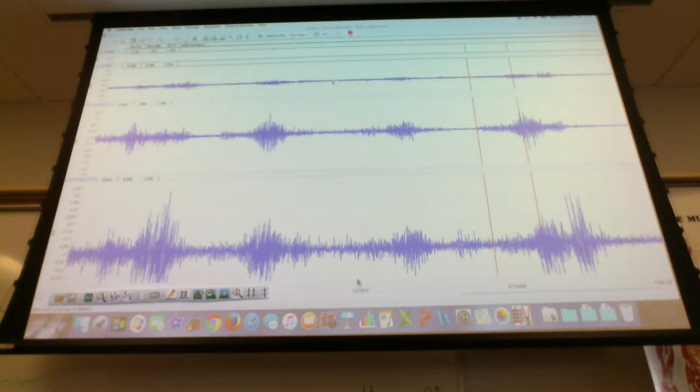You wanted to put in that box. The number of what? Millivolts, right? Millivolts of what? Of how much force they measured on the anterior EMG for extension, how much on the posterior. So we don't have any average means. Well, you guys can do the average on yours. Everybody else doesn't necessarily have as great a data. And we're just playing around with some different ways to do it.